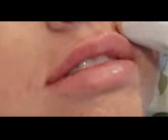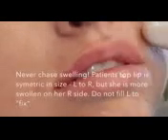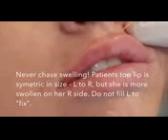So this is the only part in the top lip that's remaining. From here to here, I don't want anything to stick in. She's swelling up, so it makes the border a little bit more vague.